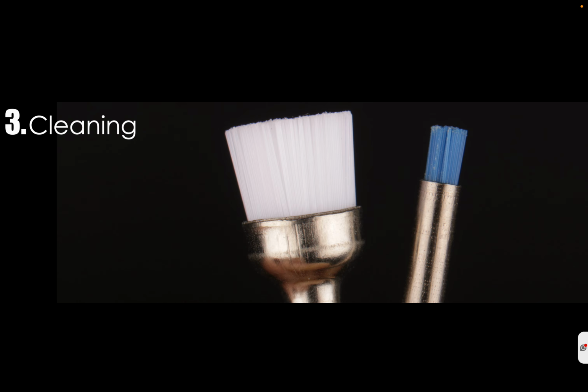And then if you want to clean a little bit more, you can use this brush with some kind of alcohol or something like that, just to remove all the dust that you have after the normal polishing.